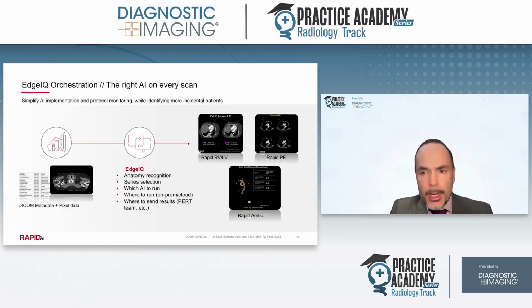So intelligently prioritizing only those portions of your data feed that are necessary for the cloud processing is going to have benefits in terms of reducing any lags and bottlenecks from overly bloated transfer protocols and so forth. And this is going to help your hospital or your server preserve critical bandwidth and storage footprint.